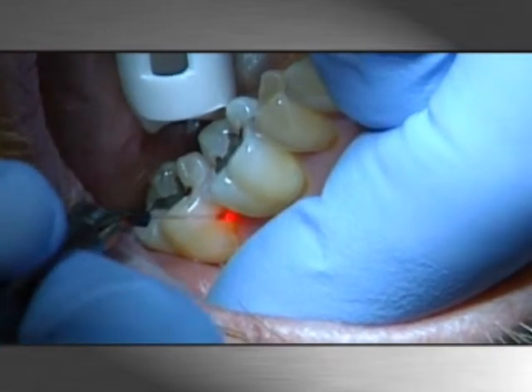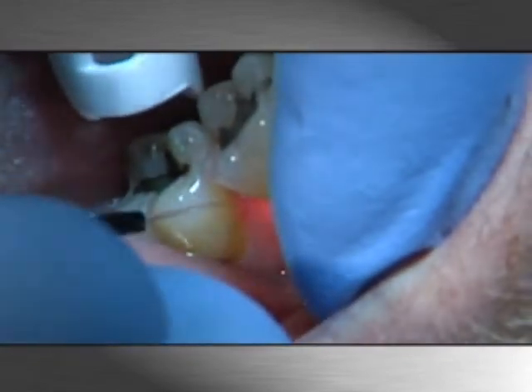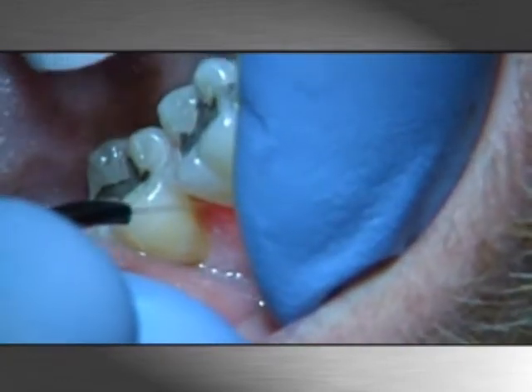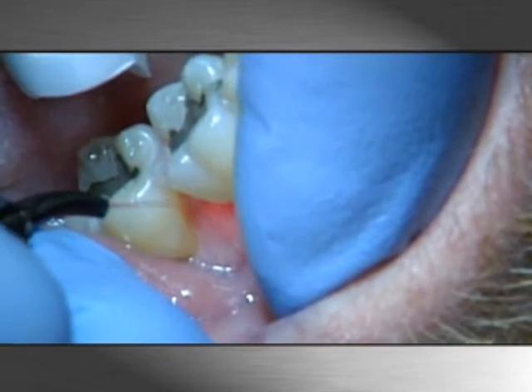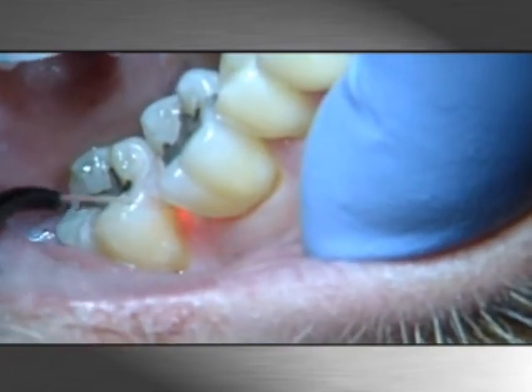The total amount of time for this laser procedure is a function of the extent of the diseased soft tissue. In general, lase pockets 6 millimeters or less for approximately 30 seconds buccal and 30 seconds lingual, and lase pockets greater than 6 millimeters for 45 seconds.